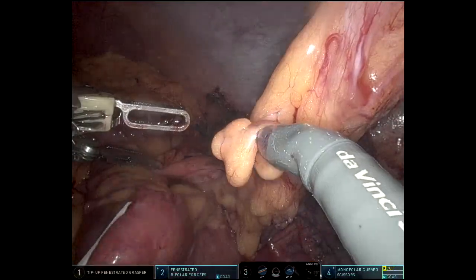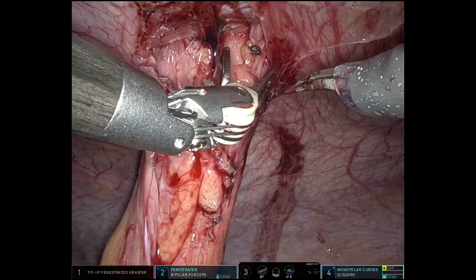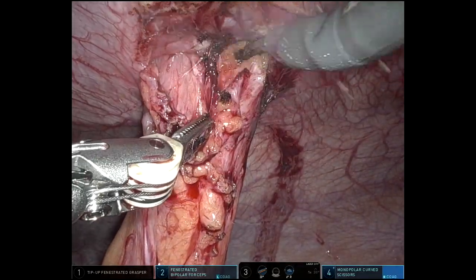Here's where I feel like I've done all the mobilization I can do up to the splenic flexure without taking down the ostomy. So I'm going to go up to the fascia here and just totally clear off the ostomy from the fascia.